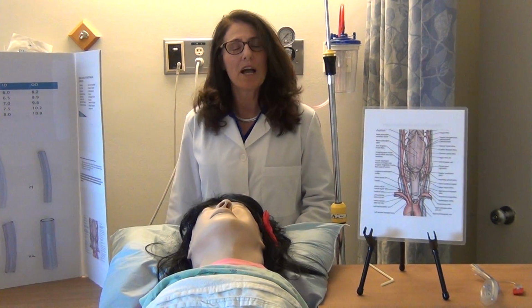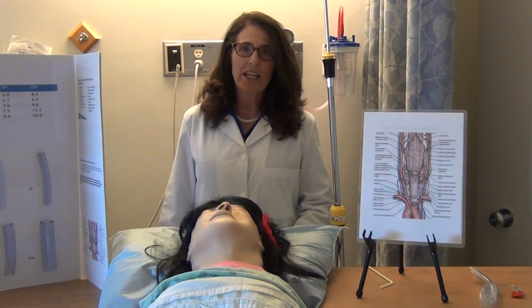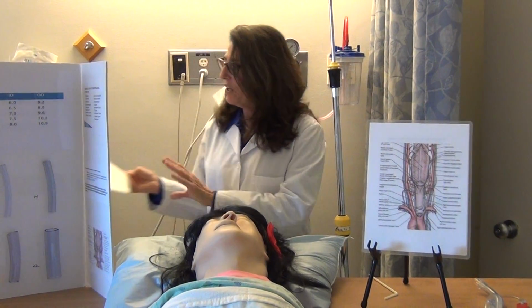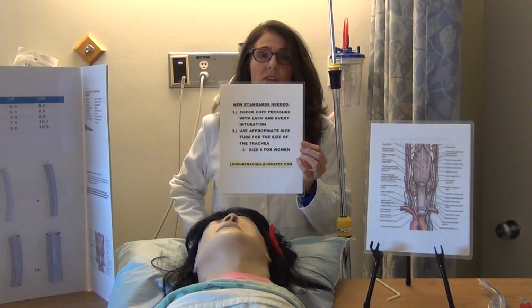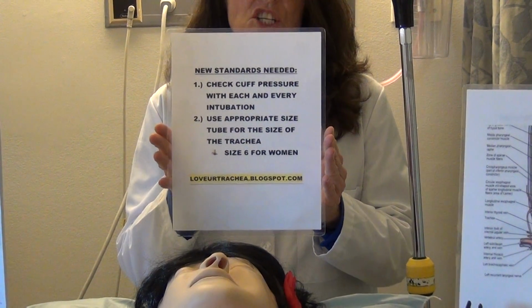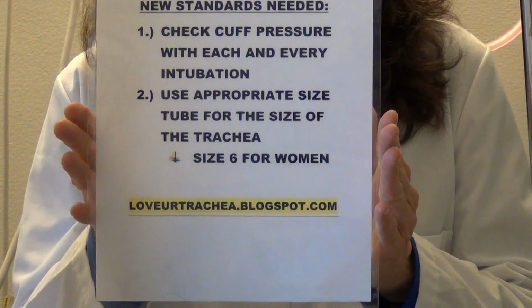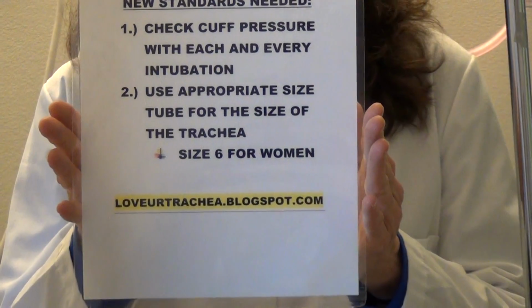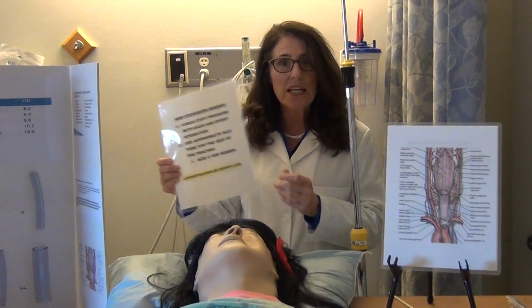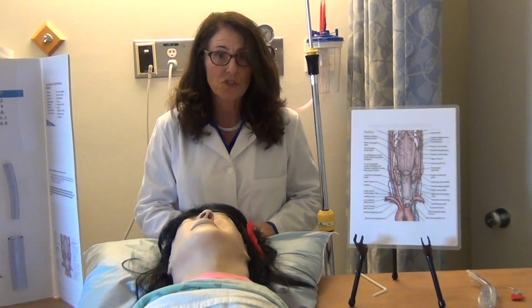I'm a nurse anesthetist, and I'm here to talk to you about the new safety measures needed to keep the patient's trachea safe during surgeries. These measures, or standards if you will, are one, to check the cuff pressure with the cuff manometer of the endotracheal tube with each and every intubation, and two, to use the appropriate size tube for the size of the patient's tracheal diameter. I'm going to begin with a demonstration of routine care, followed by why we need new standards for safety of the patient's trachea.